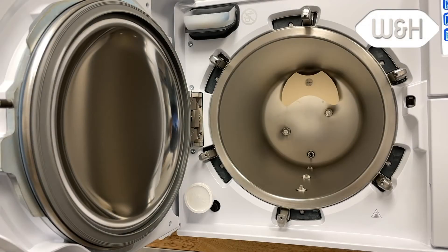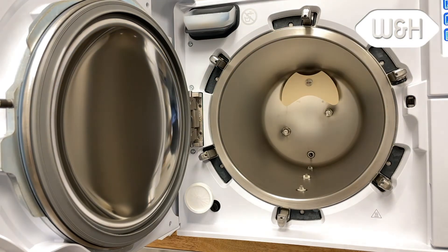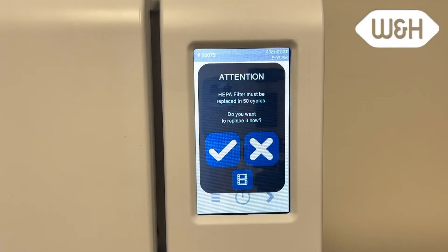There are two consumable parts on the Lexa sterilizer: the HEPA filter and the door gasket. Both consumables are replaced every 1200 cycles, which is approximately every 12 to 18 months, depending on your cycle usage. A reminder message appears 50 cycles prior to the actual replacement message, to allow time to order the replacement consumables.